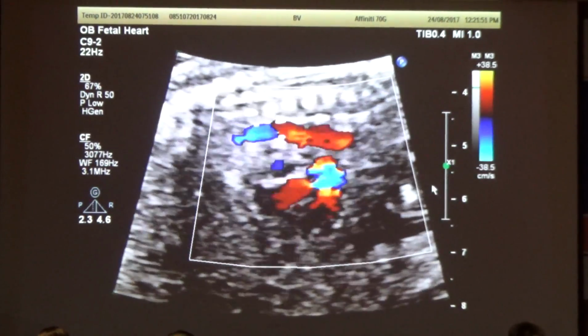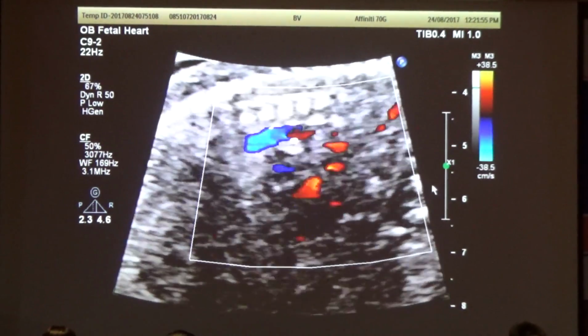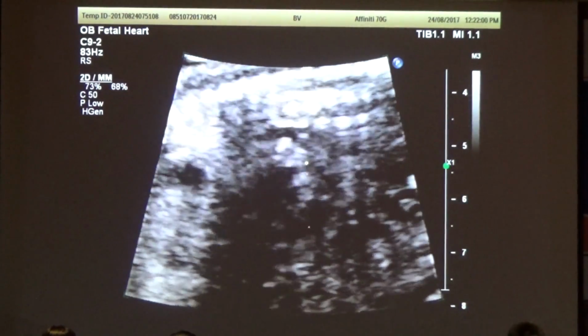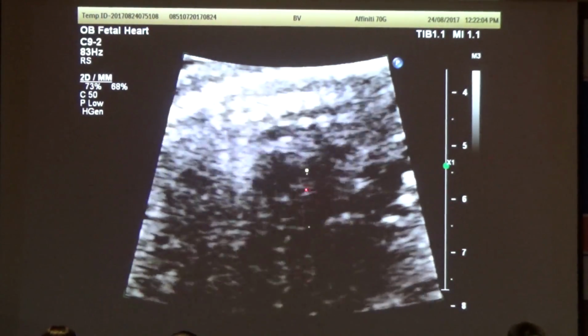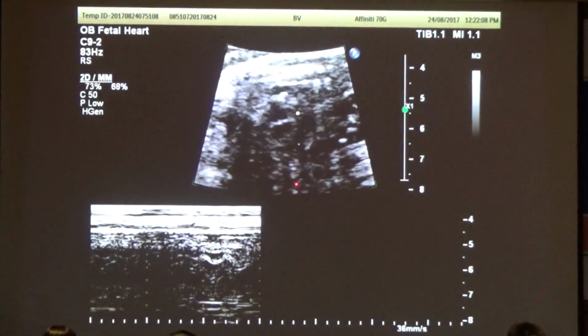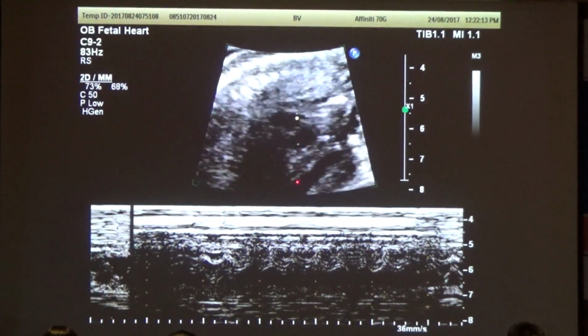There's the aortic valve. If you just do an M mode over here, you have M mode here? There you go. It doesn't say M mode on it. How am I supposed to know it's M mode? Okay, do you see this little box there in the middle? Watch when we go M mode, now you hit it again, right? Oh boy, that's great. No, now we've lost it.